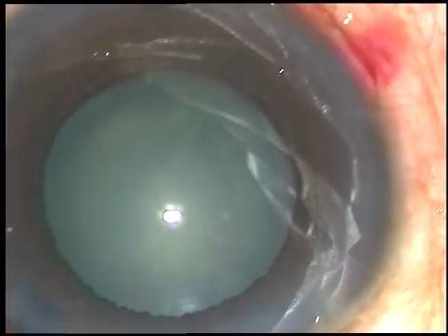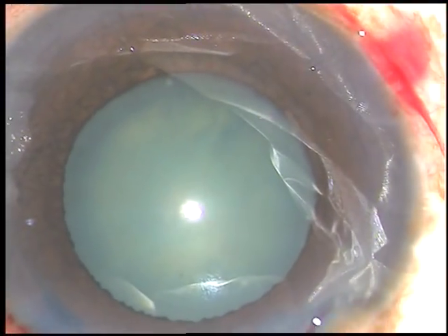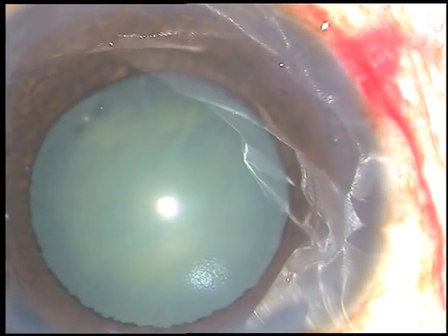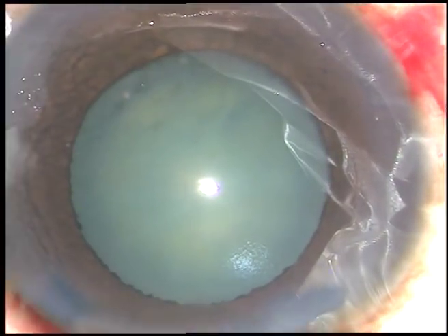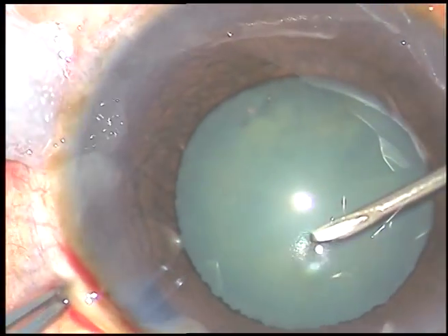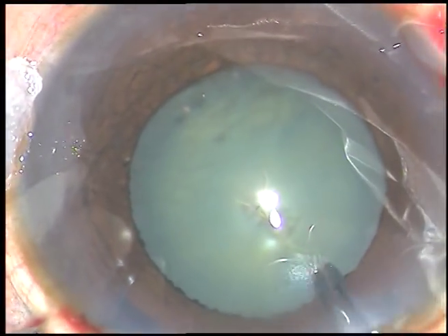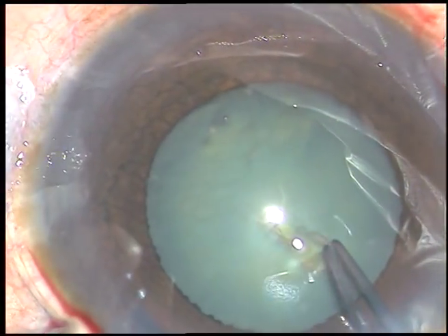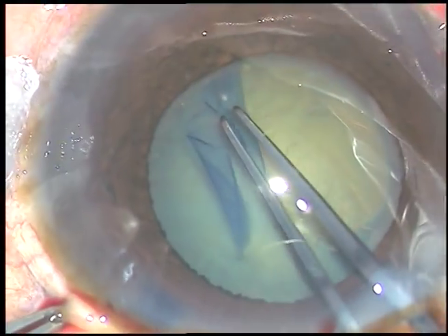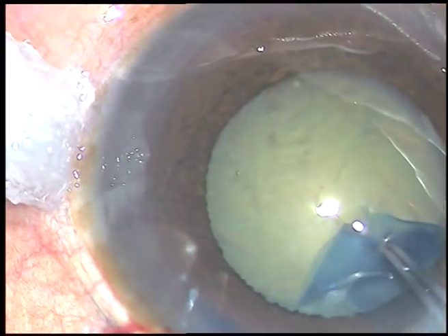And now I inject viscoelastic substance — it is 2% hydroxypropyl methylcellulose. Now capsulorhexis is to be done. I incise the capsule with a 26 gauge bent needle, raise a nice flap, then I take utrata forceps, hold this flap, and since the pupil is poorly dilated, I am going along very close to the border of the pupil.